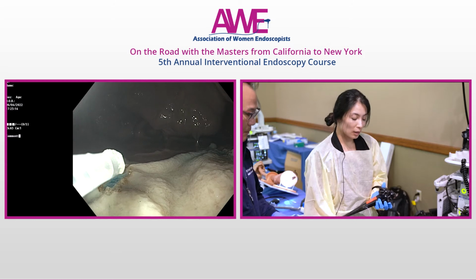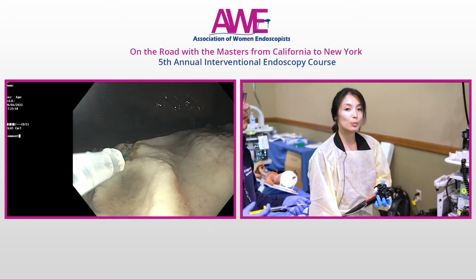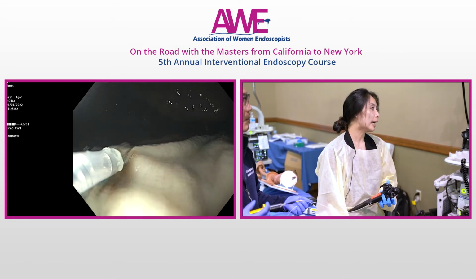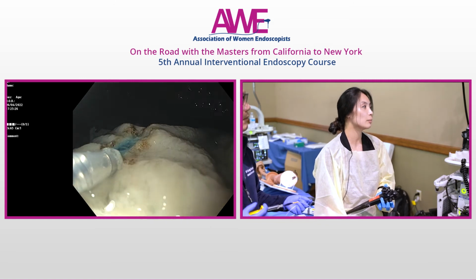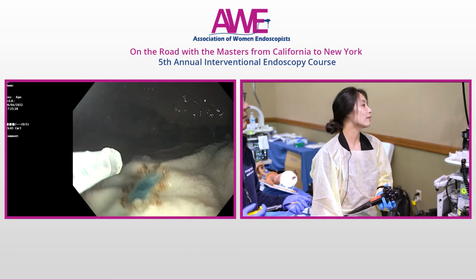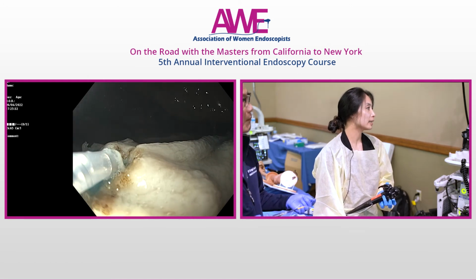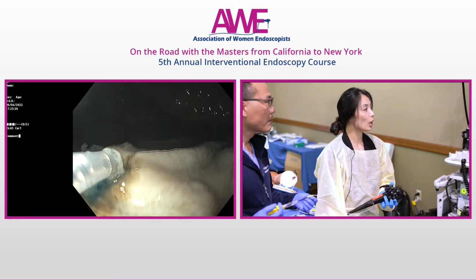So the way that I usually do this is I start from distal and then I move towards proximal. The reason being, if I start proximal and then I move distal, it does set pretty quickly, but I feel like I'm kind of pushing it off where I've already positioned it. So I always go from distal, and then I just work systematically. And then you just work with your assistant. You want to kind of do a blob at a time.